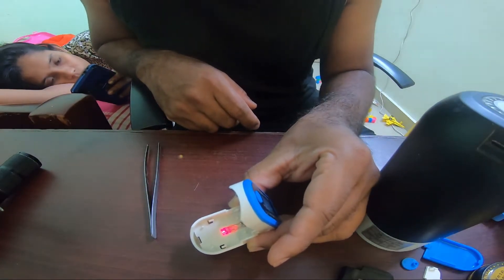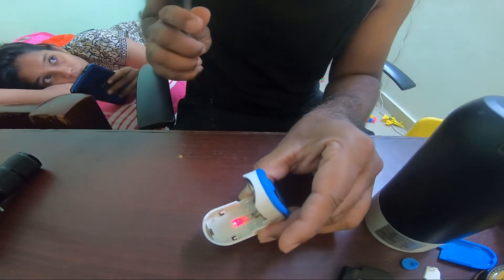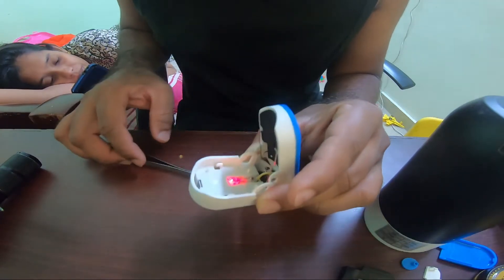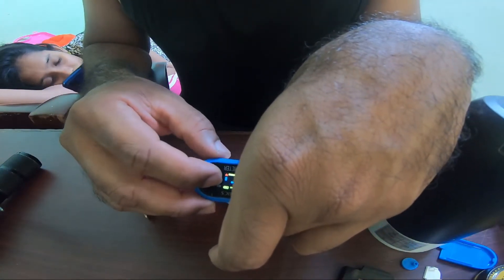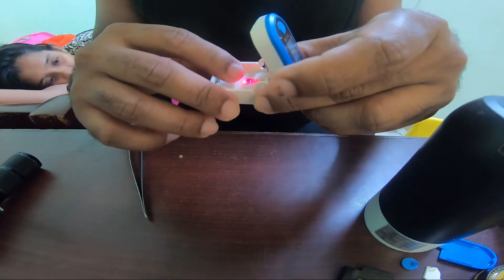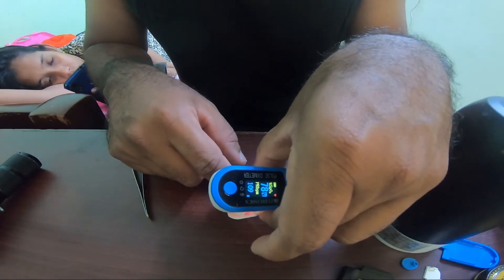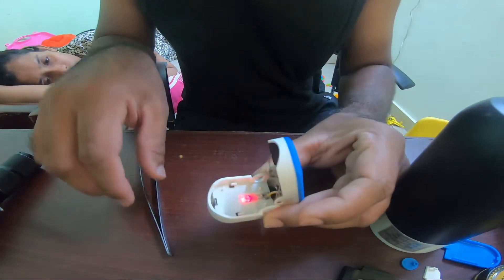The sensor is on right now. After the soldering, the sensor is working. Let's fix all this together and find out if it's reading properly. Yeah, it's kind of reading.